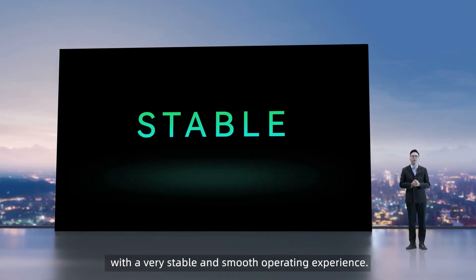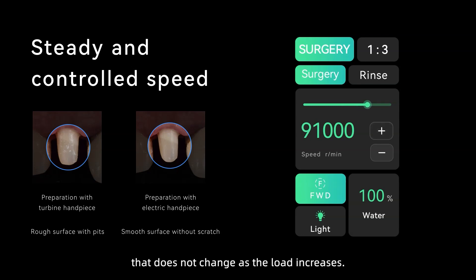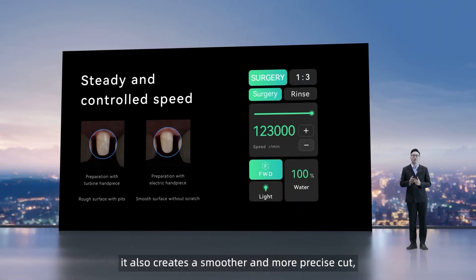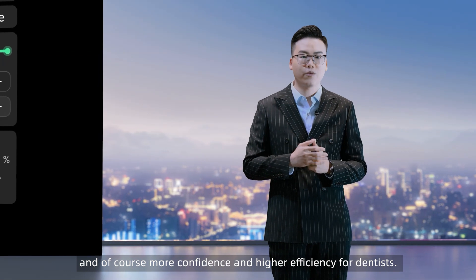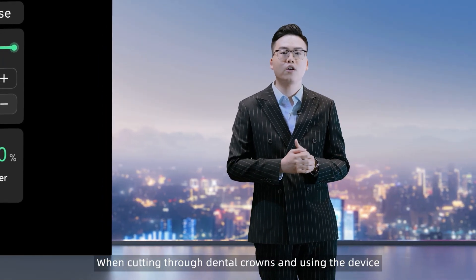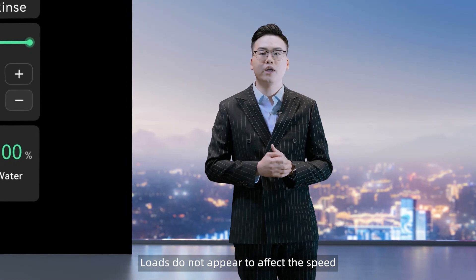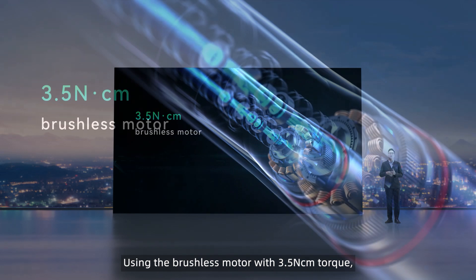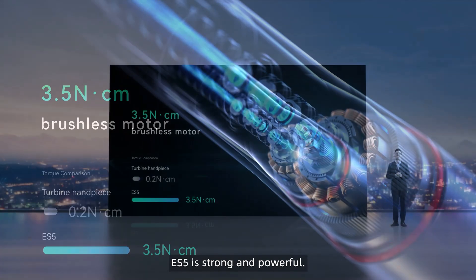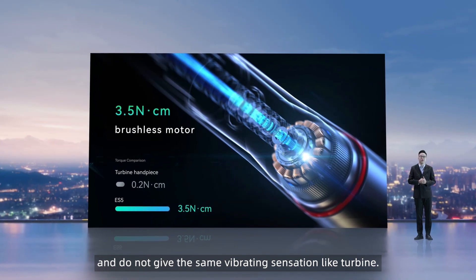Secondly, ES5 can provide a very stable and smooth operating experience. It provides constant speed and torque that does not change as the load increases. Due to the constant pace, it also creates a smoother and more precise cut, allowing for greater flexibility in preparations and more confidence and higher efficiency for dentists. When cutting through dental crowns and using the device on dense materials, it helps eliminate delays and speed variations. Loads do not appear to affect the speed and torque of the electric dental handpiece, but they do affect air-driven handpieces. Using a brushless motor with 3.5 NCM torque, ES5 is strong and powerful, and it's also liked by patients since it is quieter and does not give the same vibrating sensation as a turbine.